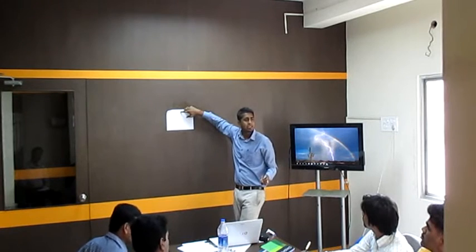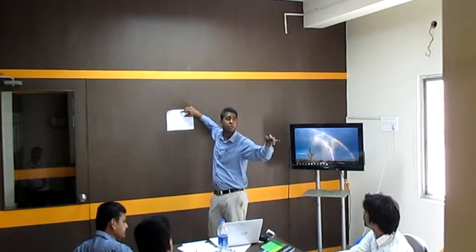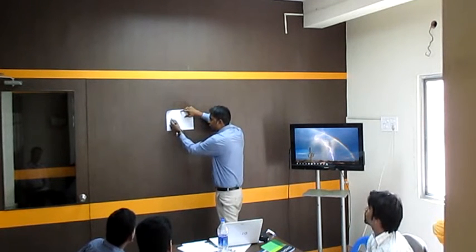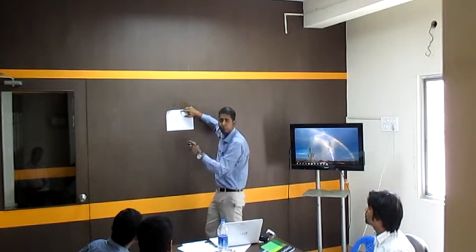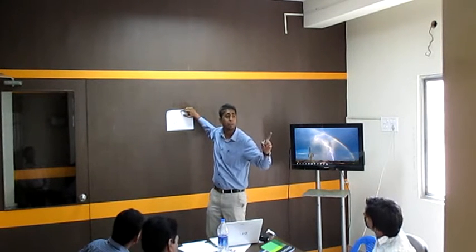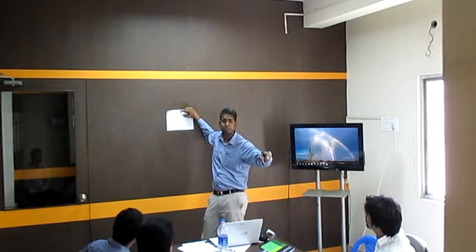What do you mean by this? A single rotation of your micromotor will cause 2 rotations of your burr. A single rotation of your micromotor will cause 4 rotations of your burr, or 5 rotations. It means it is an increasing handpiece. Why? Because input is low and the output is high.